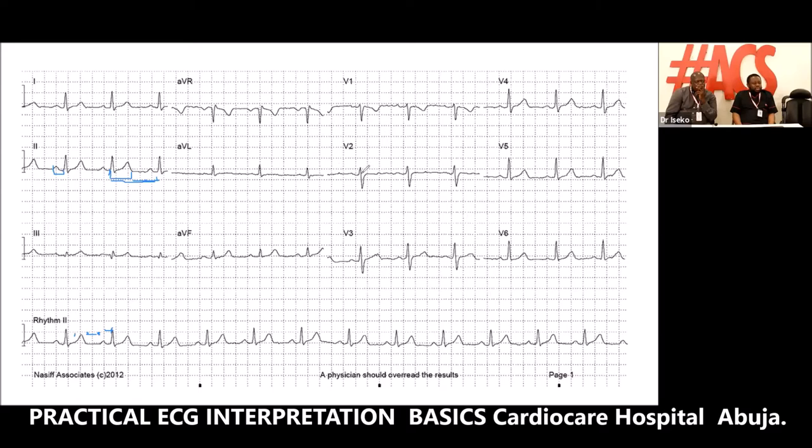Yes, virtually. So next thing, we come to the segments. The PR segment is at the same level as every other one. Next, we have the ST segment. Is there any ST elevation or depression? Remember, you're looking at the J points. Is there any? None. Great. So, normal ECG. Sign your name and collect your money.